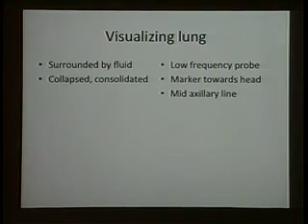Some people have said, can you quantify the amount of pneumothorax with this? Probably not. It's very hard because you're not getting a 3D assessment, you're just finding a point. So I haven't seen anybody really quantifying the amount of pneumothorax, saying you have 20% lung down, 40% down, whatever, based on the signs alone.